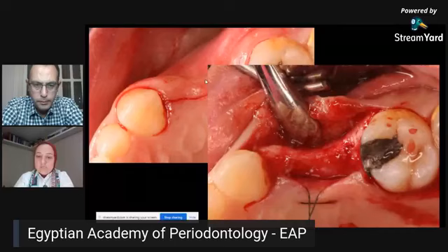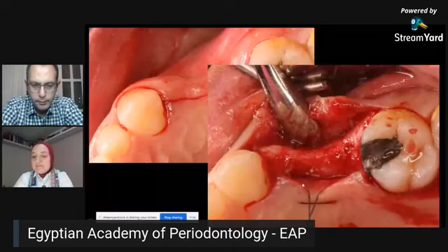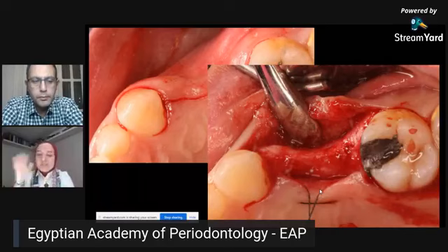And then we opened the flap. You can see the reflection of this buccal depression here. You have the buccal depression in the bone. And this is what we call a traction suture. We like to do it so that the palatal flap is reflected without inserting an instrument and making your assistant busy with reflecting the palatal flap. Maybe it slips while working. So we do the traction suture at the beginning of the surgery and it stays there until you finish. It makes things a little bit simpler.